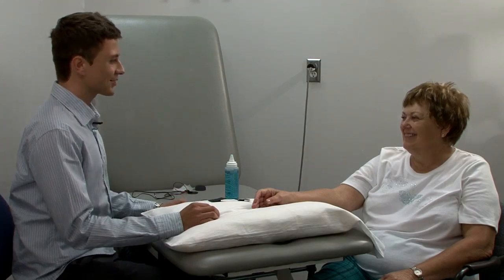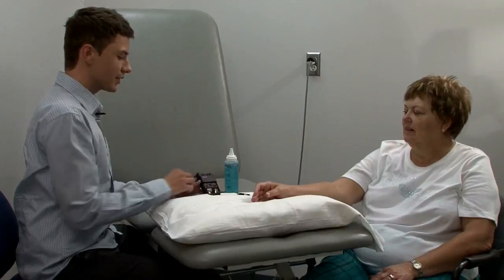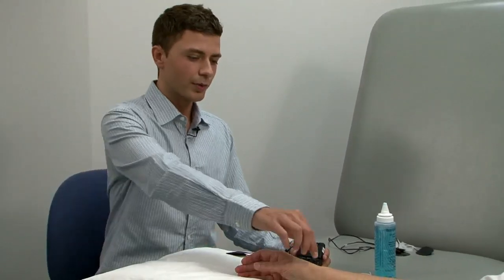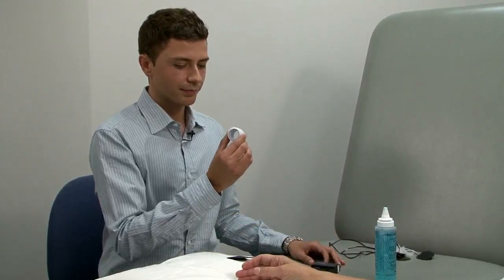Good afternoon. Today I will show you how to use the Transcutaneous Electrical Nerve Stimulation System, also known as TENS. It is basically this unit with two electrodes that we will place on either side of the forearm, right below the joint. We will hold them in place with hypoallergenic tape and we will use this gel to lubricate the pads. So let's get started.